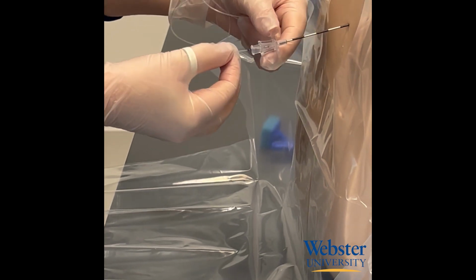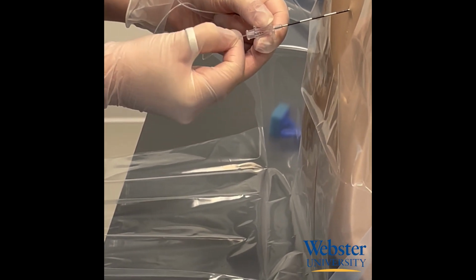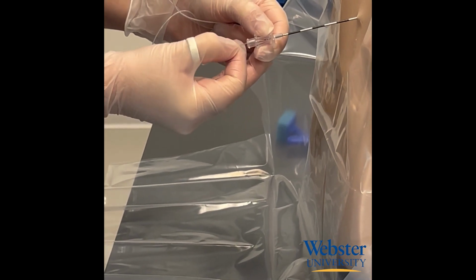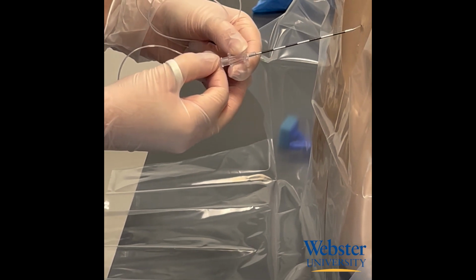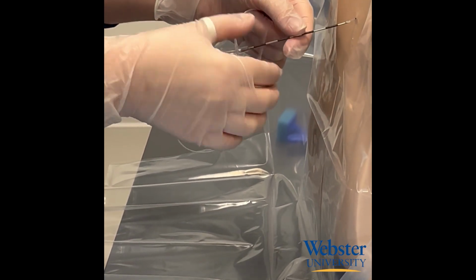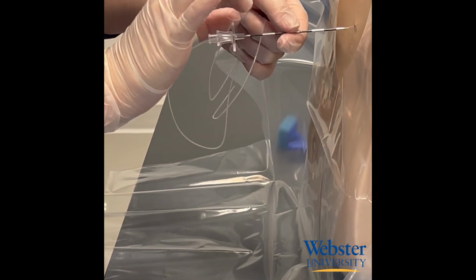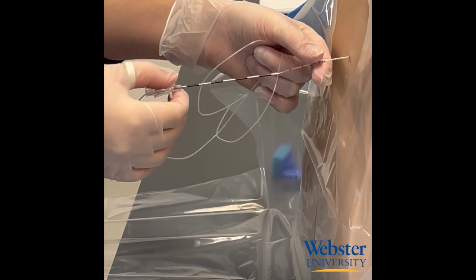You want to be very careful not to pull the catheter because you cannot just push it back in. Once the needle is out of the skin, you want to be careful and wind the catheter up on your fingers so the catheter doesn't hit someplace that is not sterile.